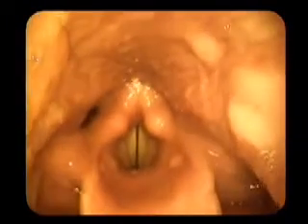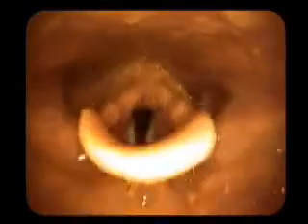The patient will now perform a glide, and then back down.